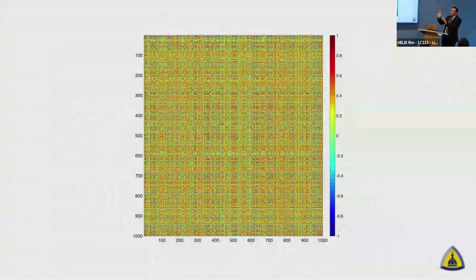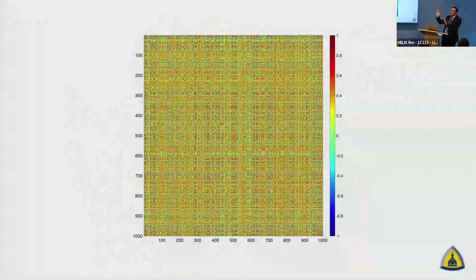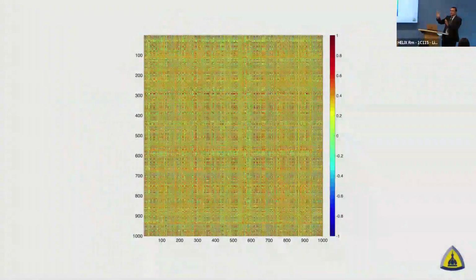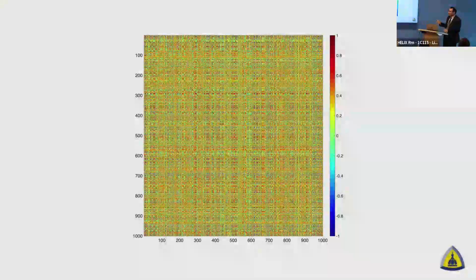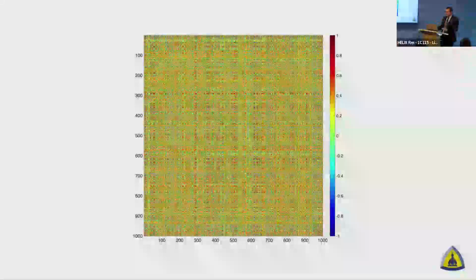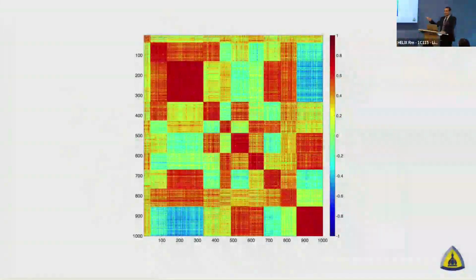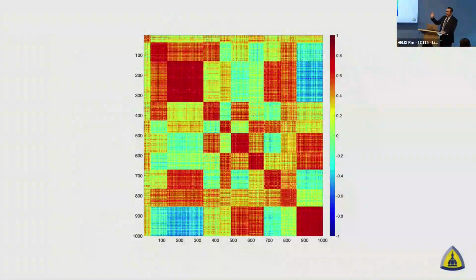Instead of having red, blue, green, yellow, orange, I'm going to move yellow 1 step forward, so red, blue, and yellow are next to each other. That's all I'm doing. If you reorganize the information a little bit, not doing any extra calculations, then you get this. Now, this is crazy, because now you see some kind of pattern in the brain, across the entire brain.